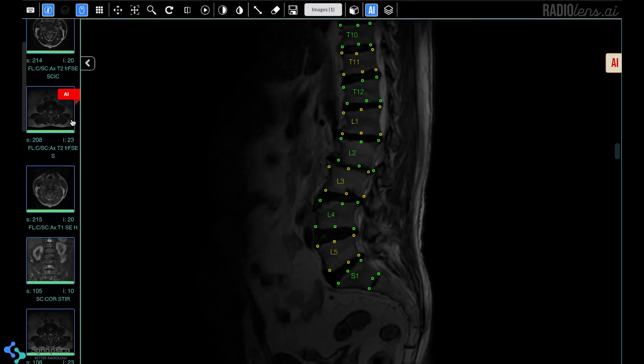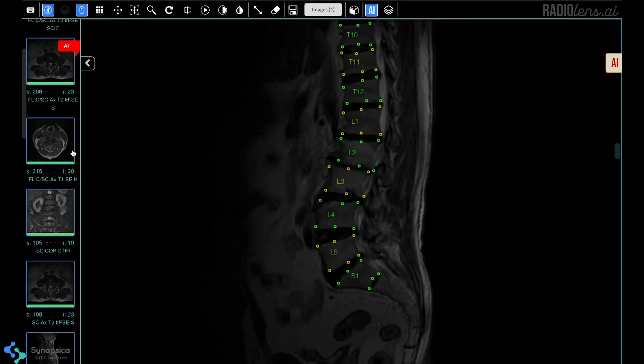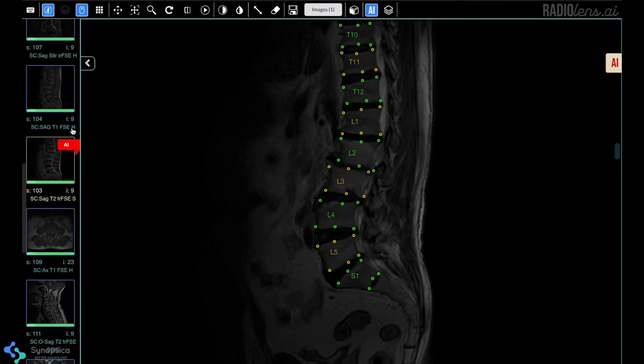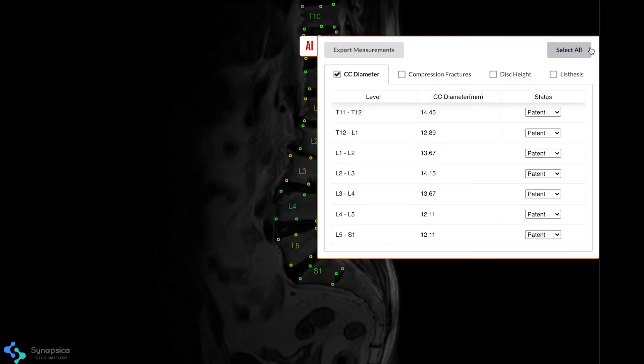Spindle easily integrates into any DICOM viewer and reporting engine to make the reporting process intuitive and efficient.